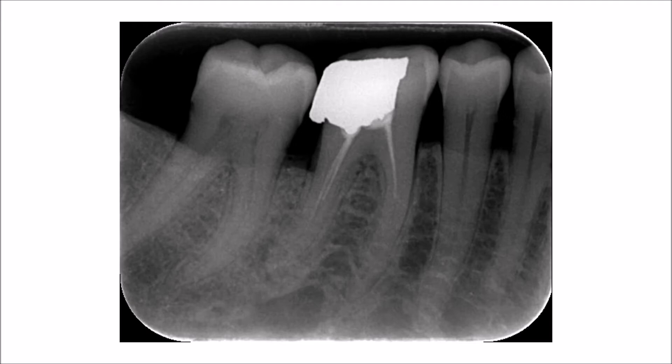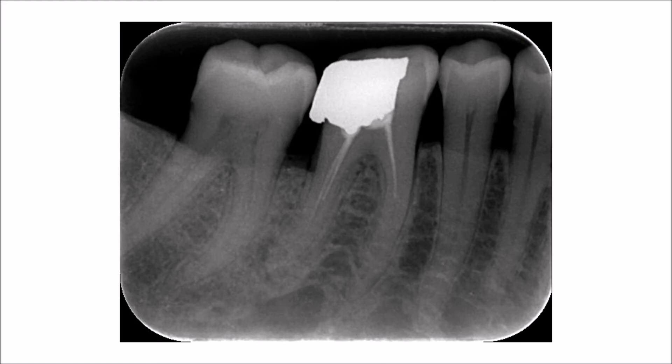As you can see in this periapical radiograph, the bone tends to maintain its parallel relationship with the cemento-enamel junction. You can also see that the overhanging margin has played a role in the initiation and progression of the periodontal bone loss in this area.